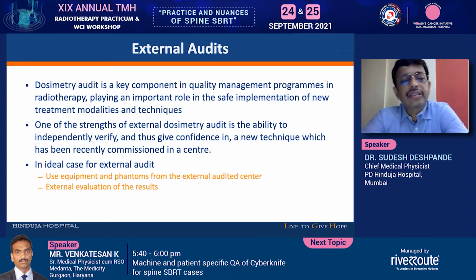In ideal cases, the external audit should use the equipment and the phantoms from the external auditing center. It means that even the chambers and the phantom that we are going to use for the external audit should not be from the same center.